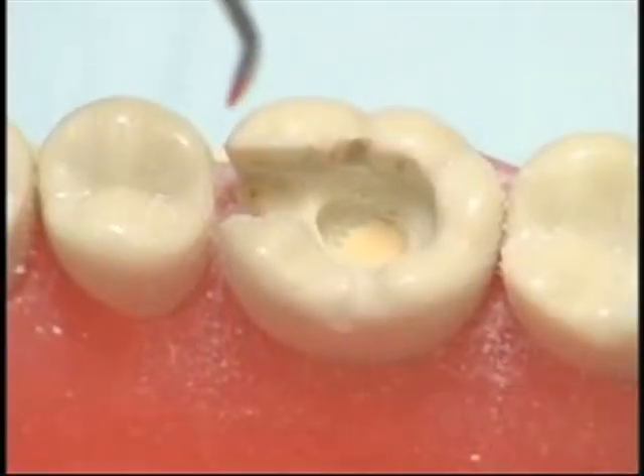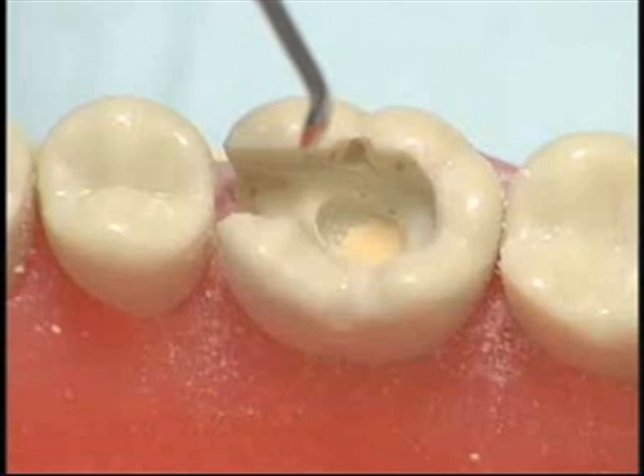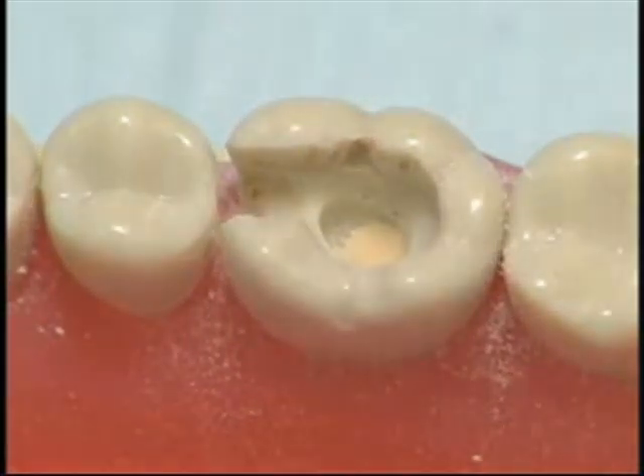Before placement of zinc phosphate cement, we cover the deepest part of the pulpal floor with calcium hydroxide to prevent the irritating effects of phosphoric acid from damaging the pulpal tissue.